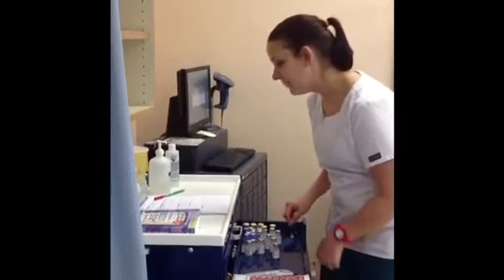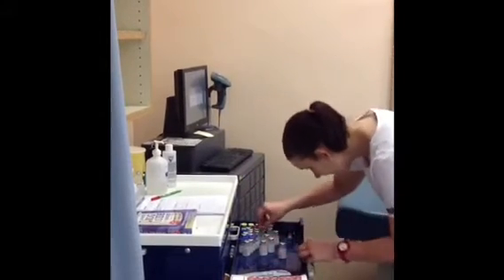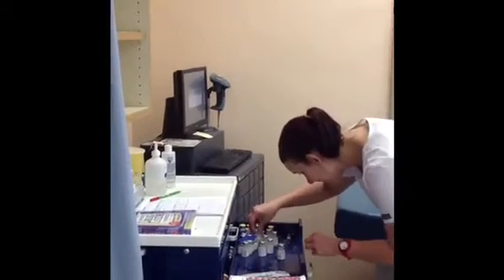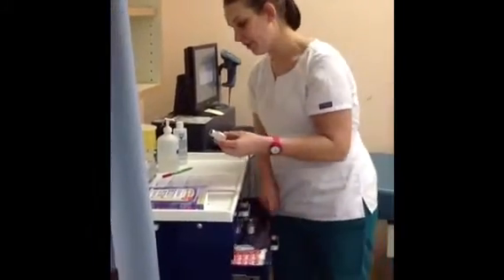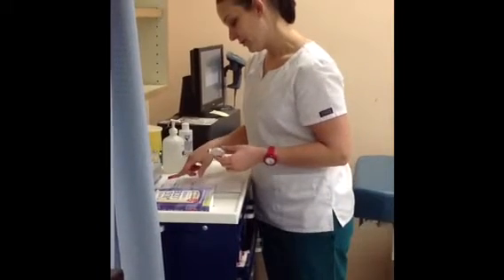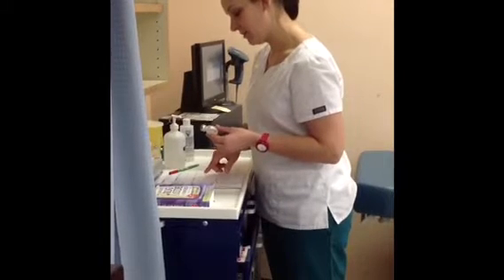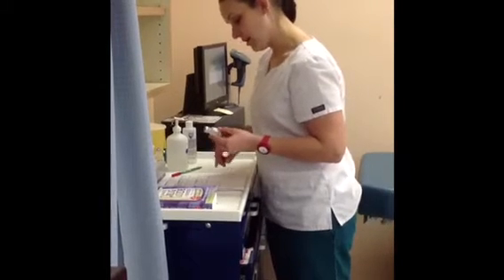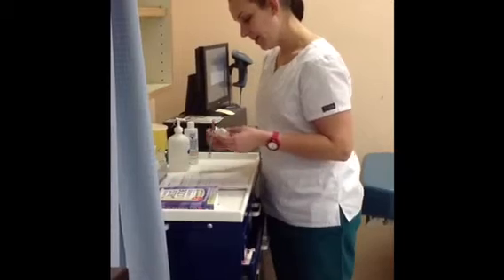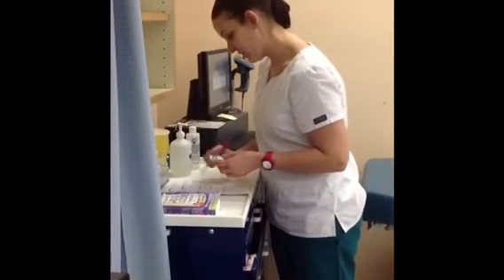I'm looking for hepatitis B vaccine. Okay, so I'm going to take it out and compare it. I'm going to check that it's the right patient, Allison Alvarez. I'm going to check it's the right medication, hepatitis B. The dose is 0.5 milliliters. It's not expired. It's an intramuscular injection. In order, I have consent from the parents. So I'm just checking everything off.